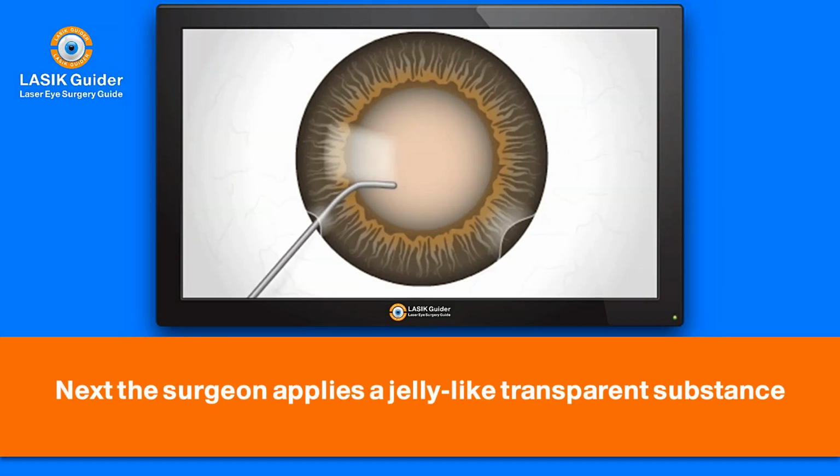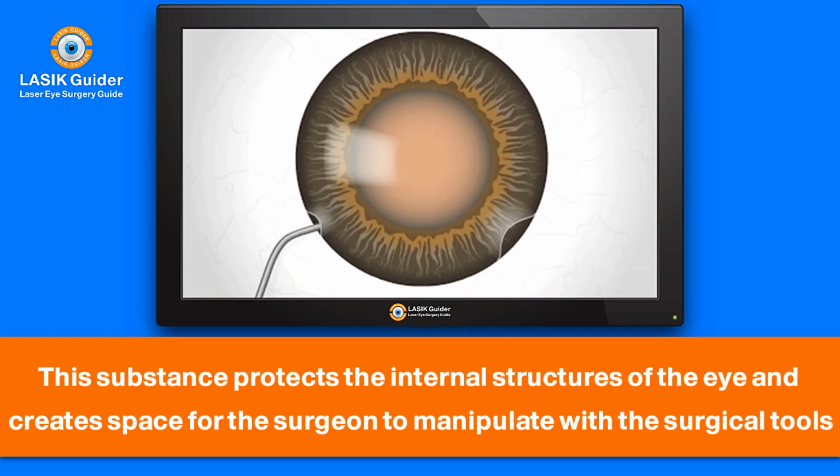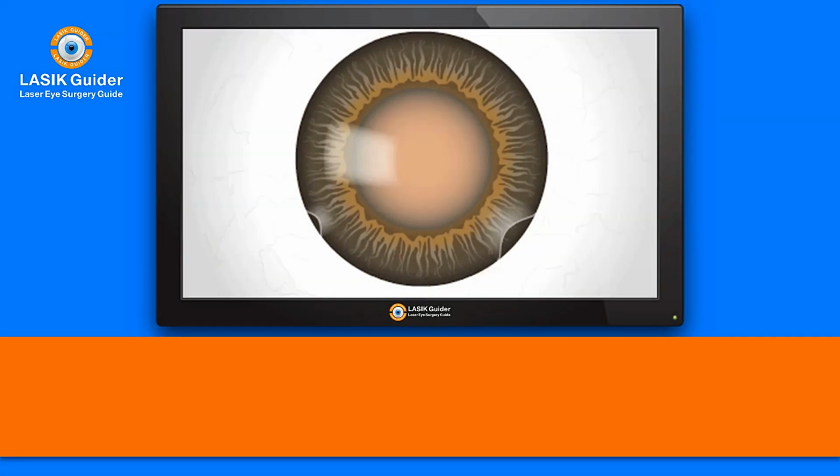Next, the surgeon applies a jelly-like transparent substance. This substance protects the internal structures of the eye and creates space for the surgeon to manipulate with the surgical tools.